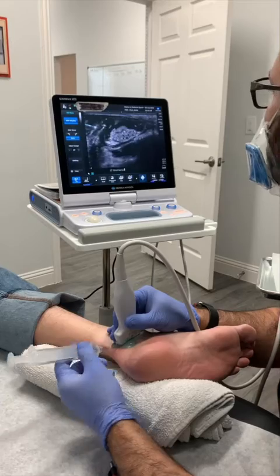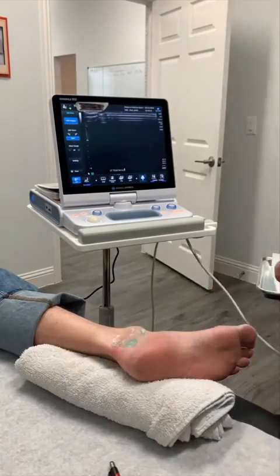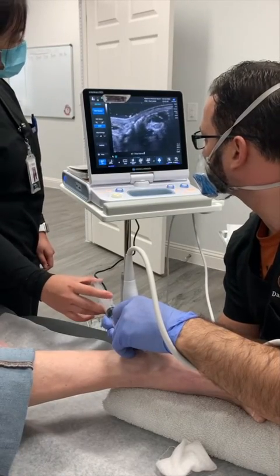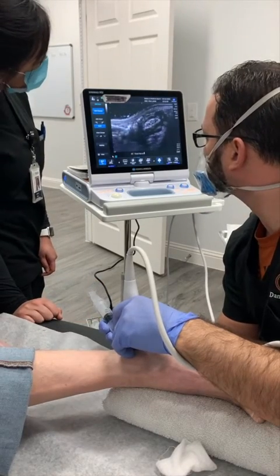We then clean and bandage the area, and in this case repeat the procedure on the opposite side as this patient had bilateral symptoms. In this clip, you can see the separation of the nerve from the surrounding tissue very well on the ultrasound screen, showing a successful hydrodissection.